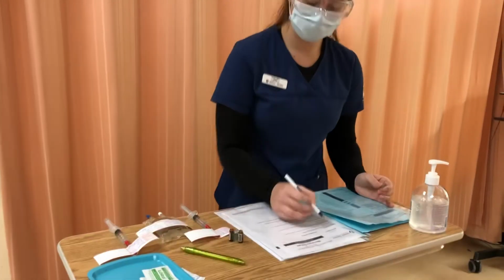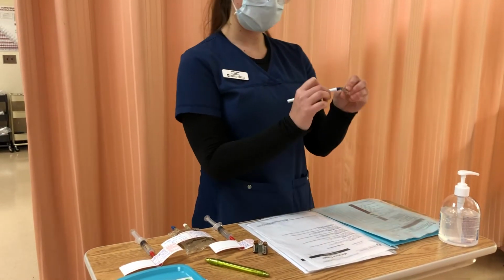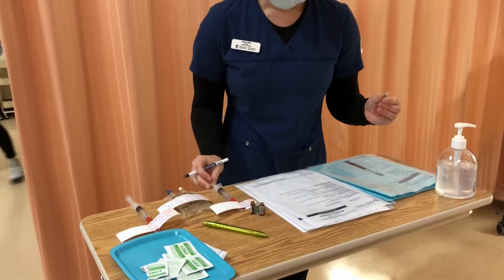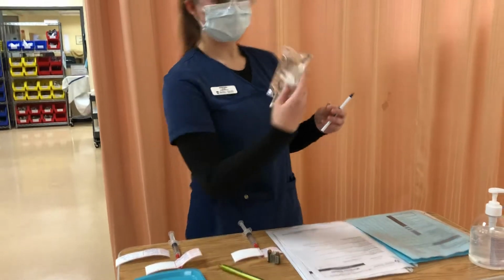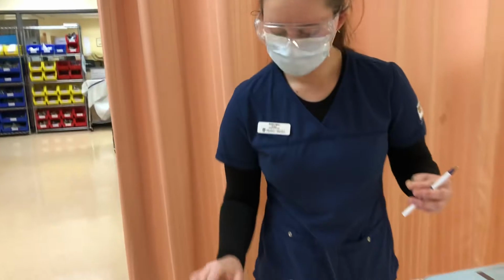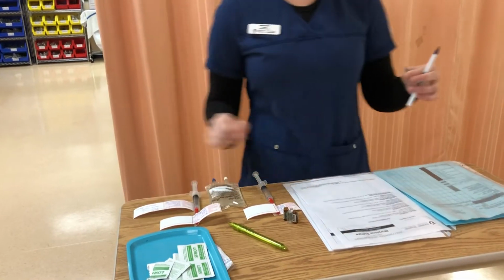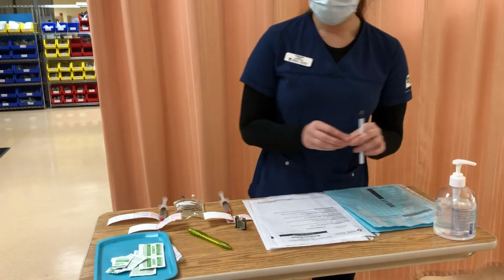This is 1 milligram per milliliter, so I've used the recipe for 1 milligram per milliliter, which means drawing up 50 milligrams, which is 5, 10 milligram per milliliter, 1 milliliter ampules for a volume of 5 milliliters. And so that says this is a final medication volume of 5 milliliters. And these are 1 milliliter ampules. I will then be diluting that with 45 milliliters of normal saline. So here I have 50 milliliters of normal saline, and I took out 5 milliliters to discard to give the bag volume 45 milliliters. So that will give me a final volume of 50 milliliters once I add the medication. And a final concentration of 1 milligram per milliliter.